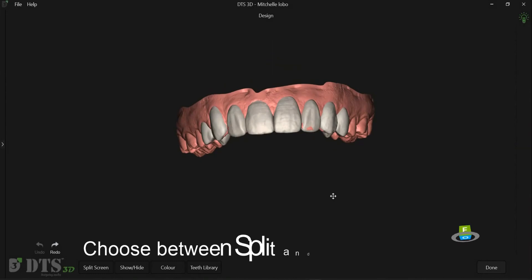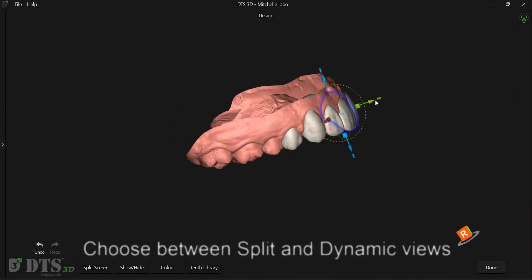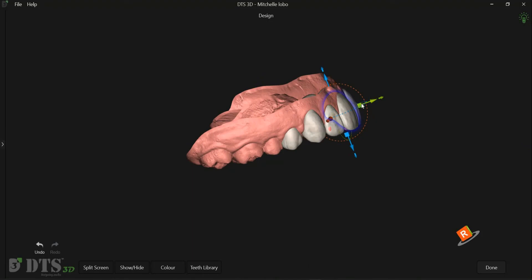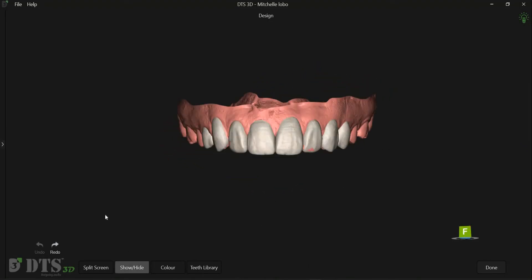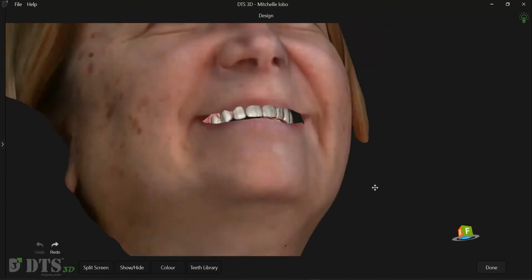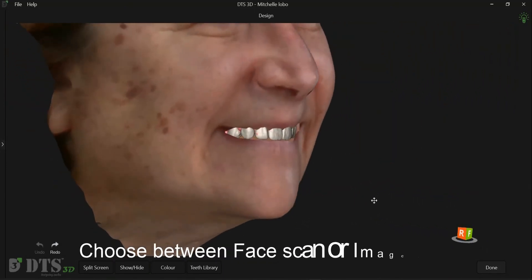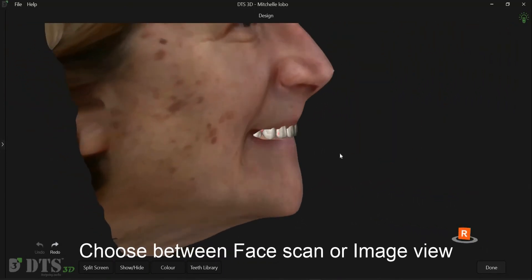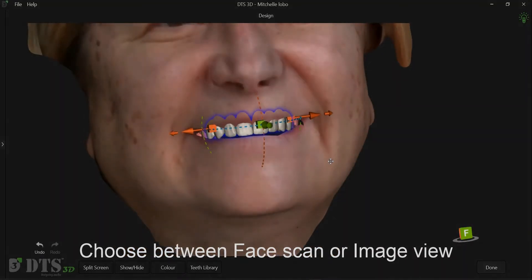We can easily navigate between the Split Screen and Dynamic Design screen. All changes can be carried out on either of the screens. We can also opt between the 3D face scan view or the image view.